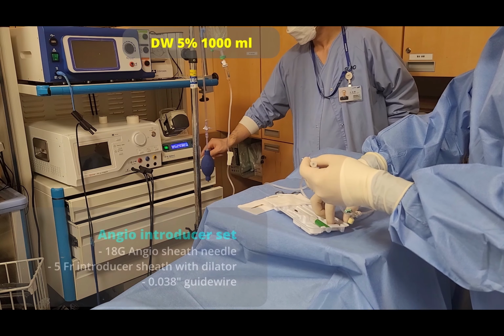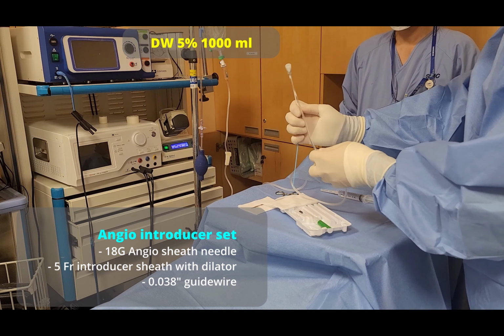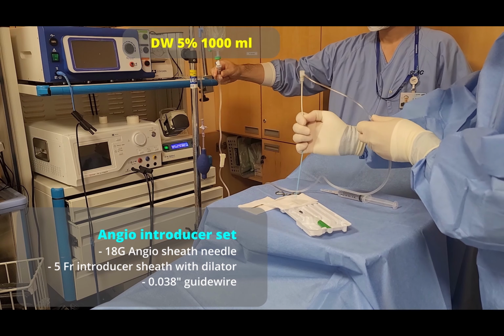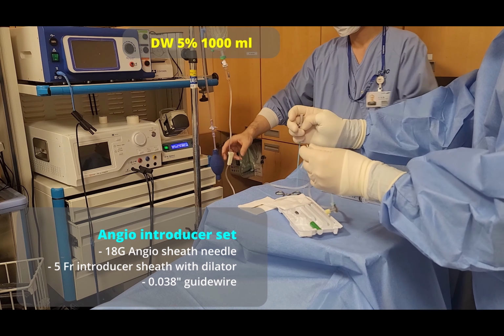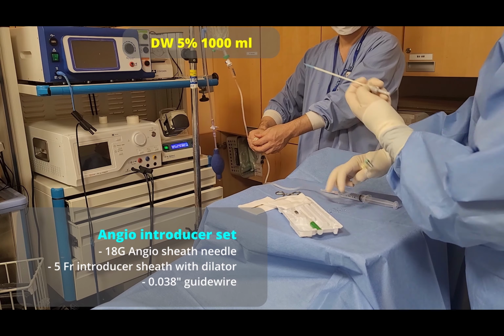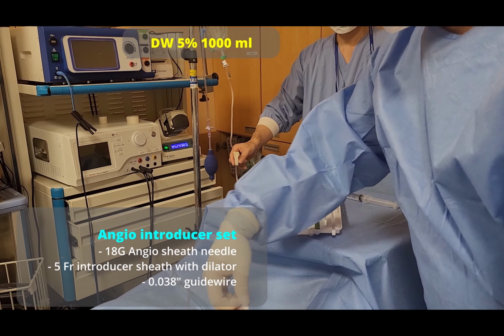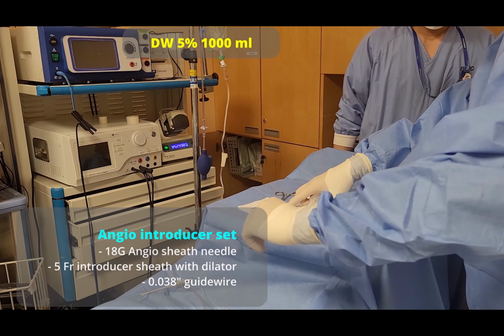We use a BP cuff to infuse more rapidly. Our operation is not so big compared to the University of Beijing.